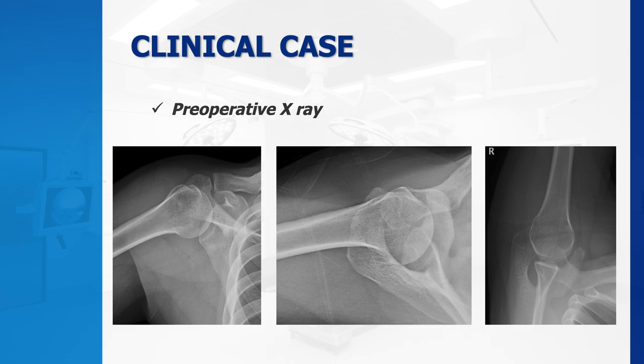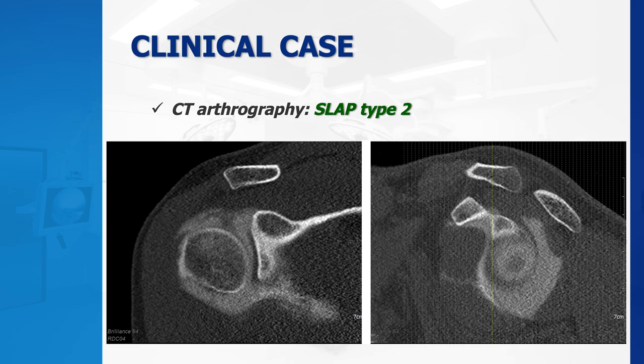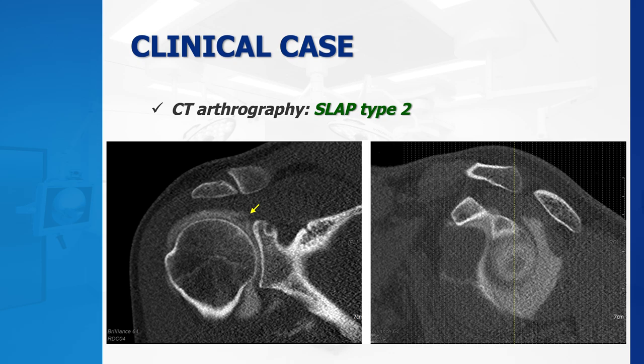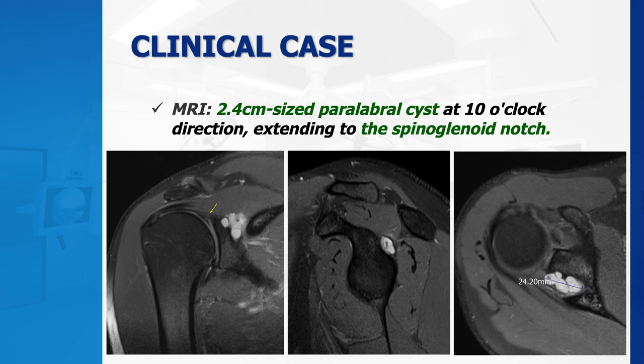On the CT arthrogram, you can see a type 2 SLAP lesion, and also the chronic cyst-related bony change on the posterior superior glenoid labrum. On the MRI scan, you can see the definite type 2 SLAP lesion with a spinoglenoid ganglion cyst. The maximum diameter was 2.4 centimeters.